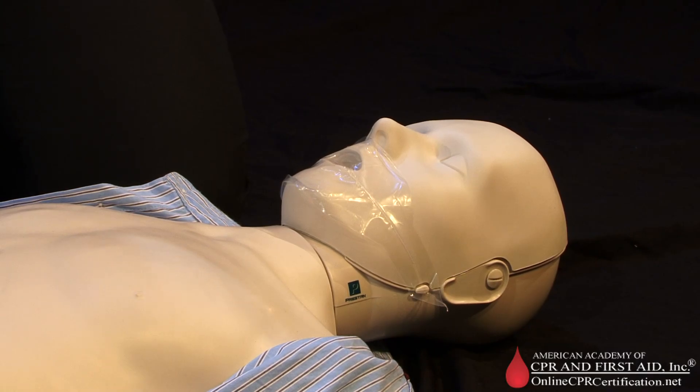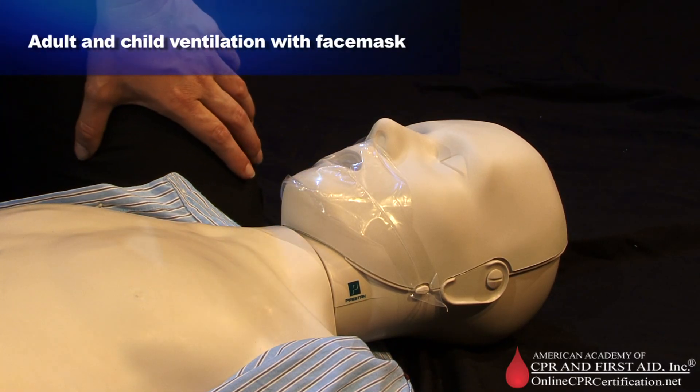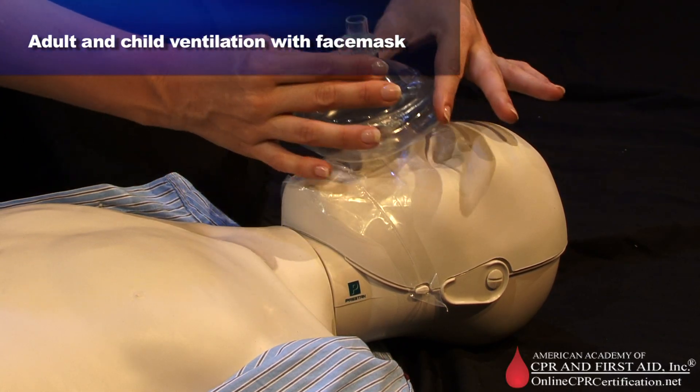In this video, we will show you the technique for ventilation with a face mask for adult or child. Position yourself at the victim's side. Place the mask on the victim's face with the V shape of the mask on the bridge of the nose.